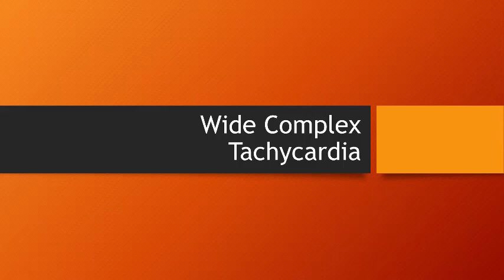Hello everyone. Today we will talk about wide complex tachycardias. Wide complex tachycardias include VT and supraventricular tachycardias with aberrancy. They both pose difficulty in interpretation because of the resemblance they present on ECG, and it is a topic of great concern for all, especially for young graduates.